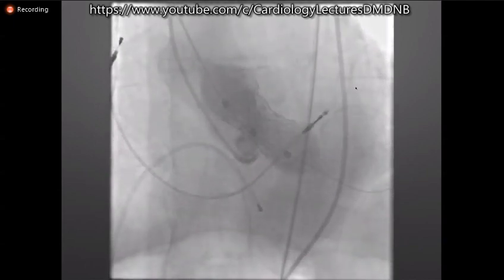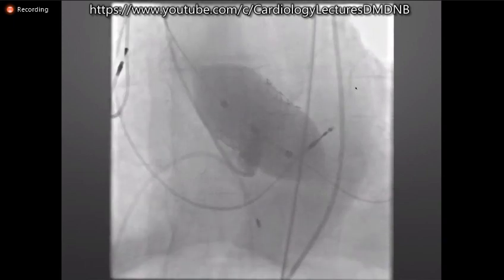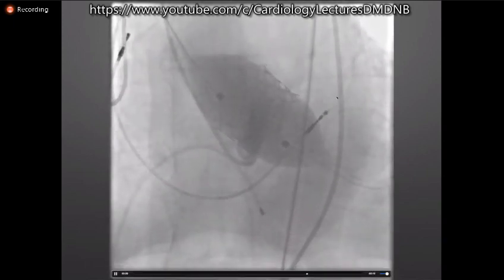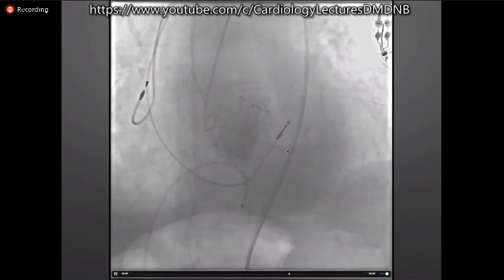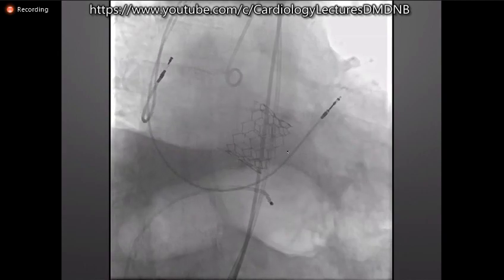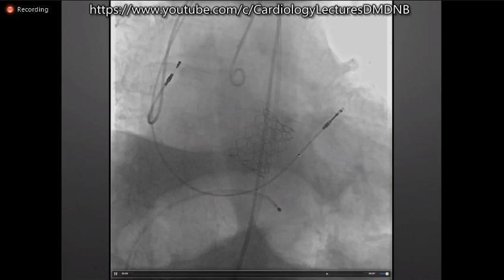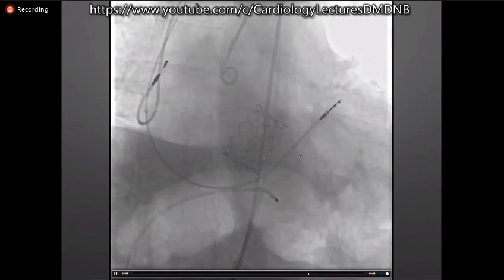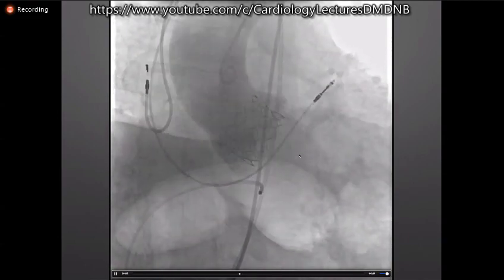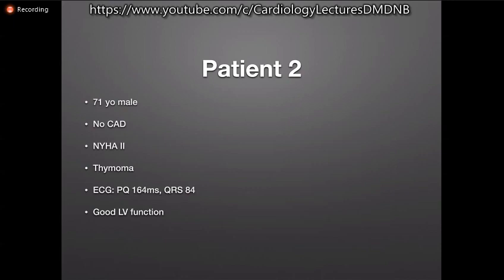As you can see on the non-coronary cusp side, the valve moved a little bit higher. We aimed for that because of the larger cusp on the non-coronary side, so we thought it would be quite good for the anchoring. We did the angiogram with the pigtail inside, so we can see some regurgitation to the LV. Then we removed the pigtail, and the regurgitation is small, so we were happy with the result. Even in this large anatomy, you can place the valve safely, with no stenosis, no residual gradient, and no severe regurgitation. We did the angiogram after the procedure. Everything was okay, and the patient was discharged home 2 days after the procedure.